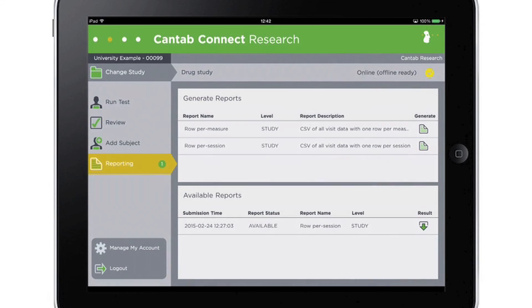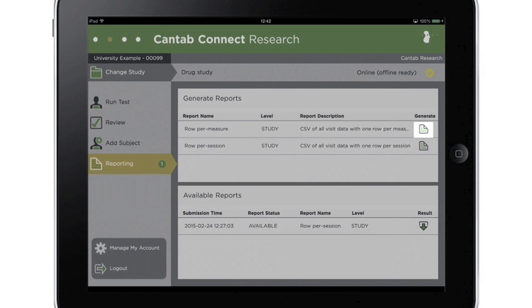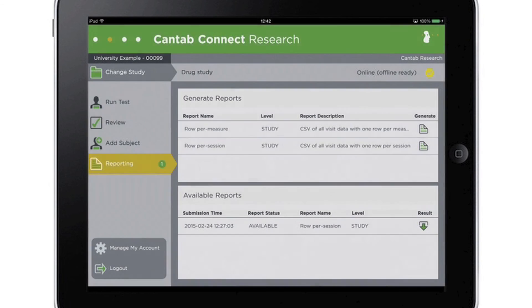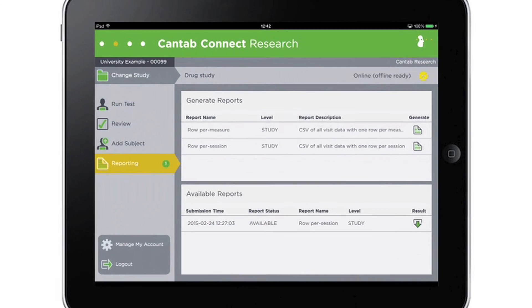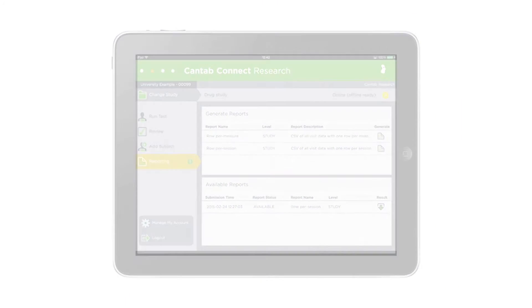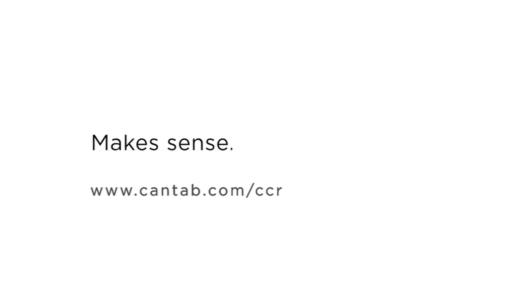To access the study data, simply select a report format and a CSV file will be generated, ready to be interpreted or imported into a statistical package for further analysis. For more information about Cantab Connect, visit www.cantab.com or contact the team at Cambridge Cognition.